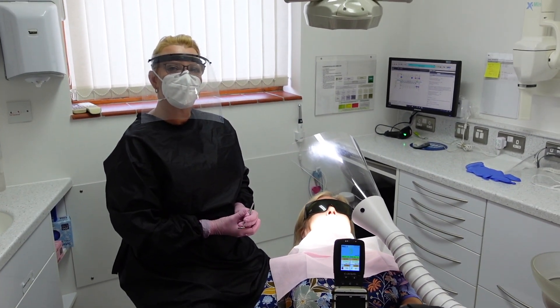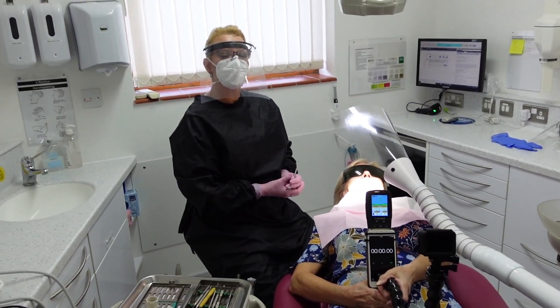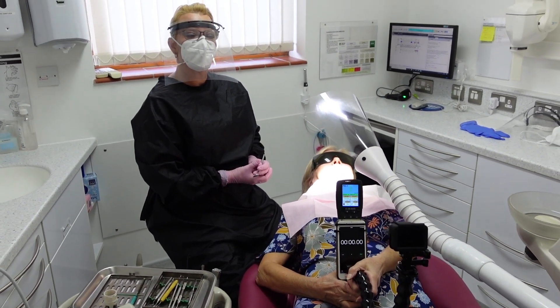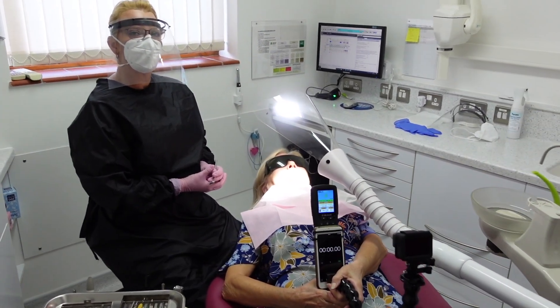Susie, my dental therapist and my wife, obviously all in my social bubble so we're all fairly safe even though we're actually going to be wearing PPE. So first we're going to be getting on with the readings in relation to the scalars and then we'll move on, we'll do that in sections hopefully in this one video.